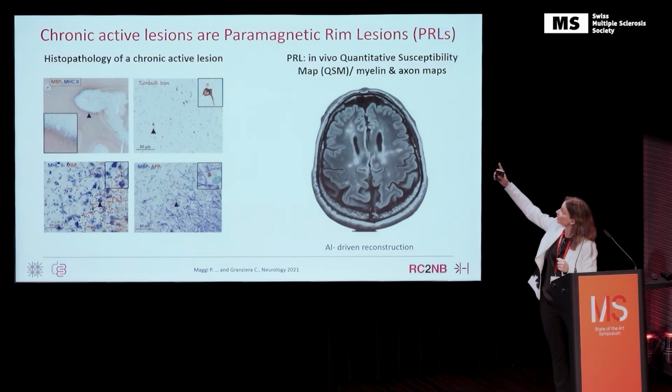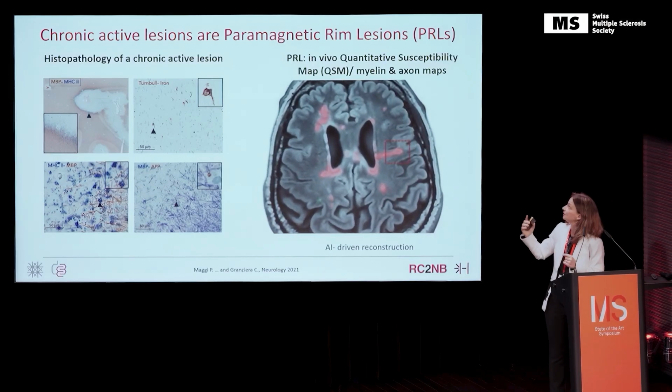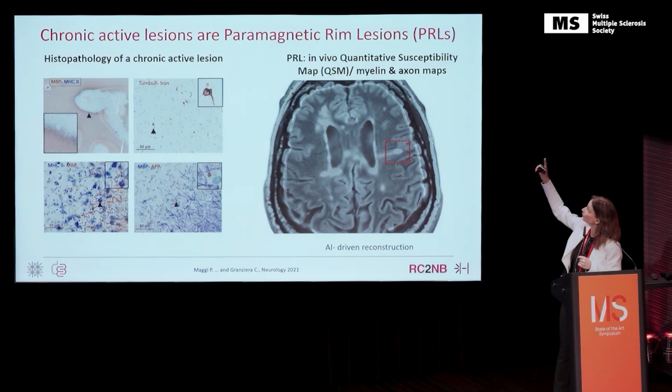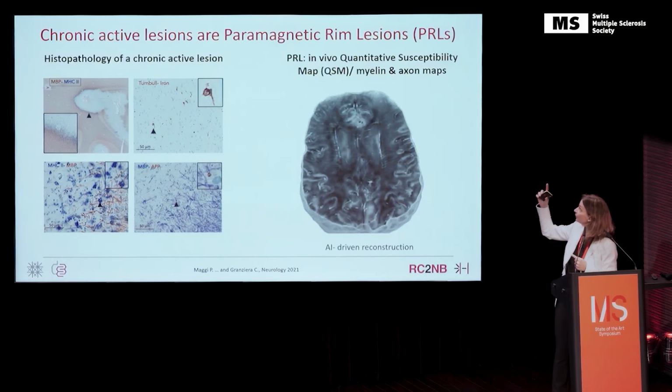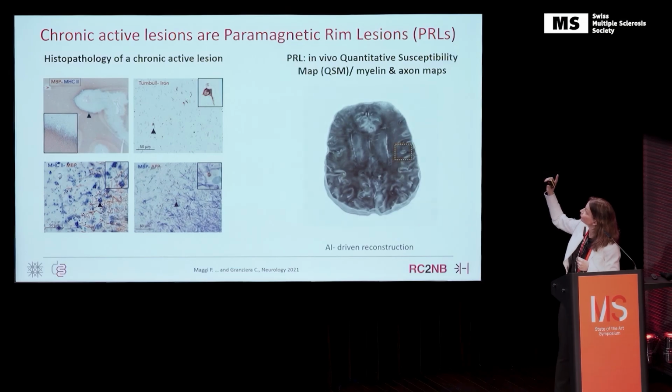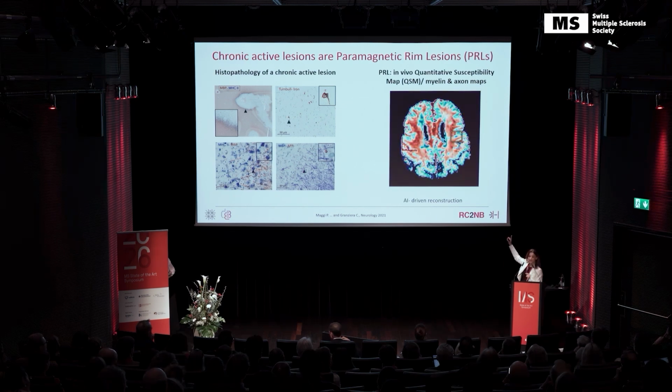So this is the brain of an MS patient. You see the lesions, you see in red the lesion mask. And now we focus on that lesion, which appears in a QSM map having this white rim, and this is iron. But the most interesting thing is that if you use a myelin map, this lesion is completely blue, which means complete lack of myelin. And in an MRI axon map, do you see the bluish core and the surrounding, which is a bit less bluish? This is lack of axons.